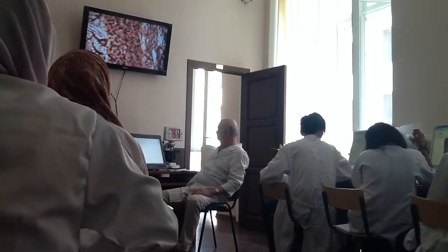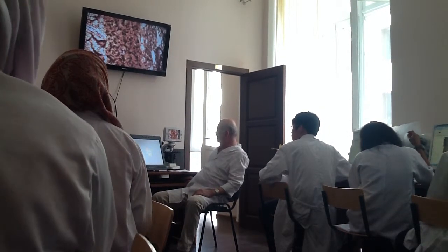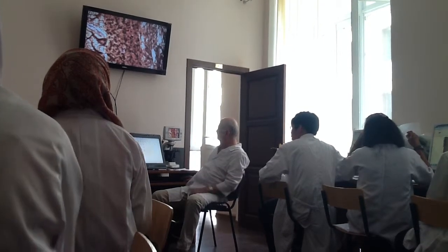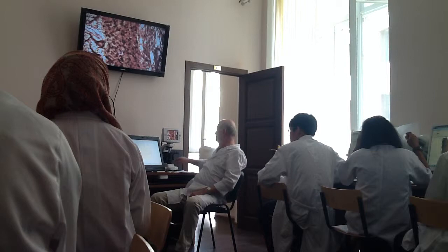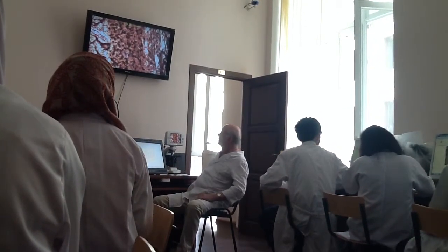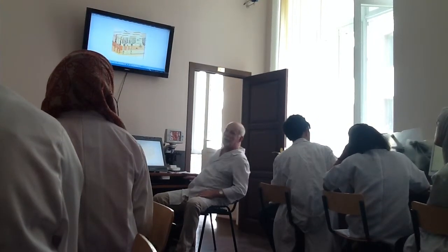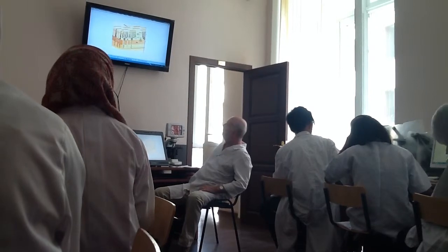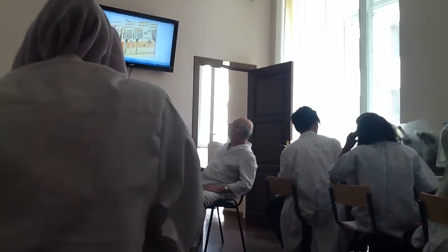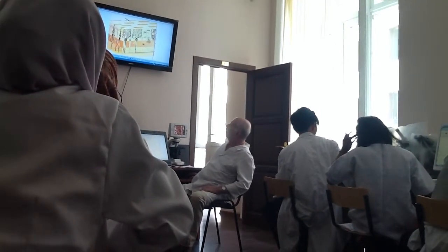And finally, I'll show you a scheme that demonstrates interneuronal interactions between neurons in the cerebellar cortex. Molecular layer, ganglionic layer, granular layer, white matter.